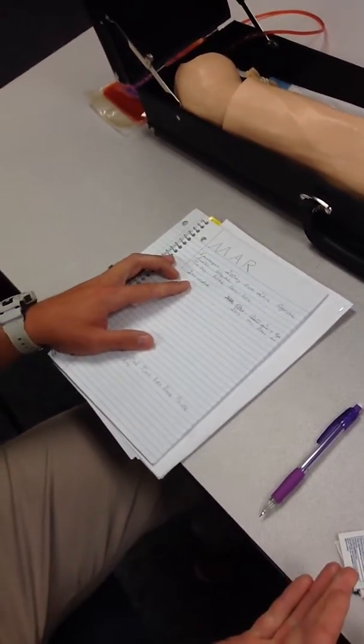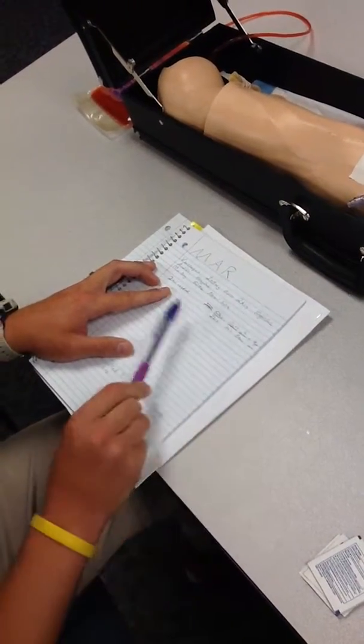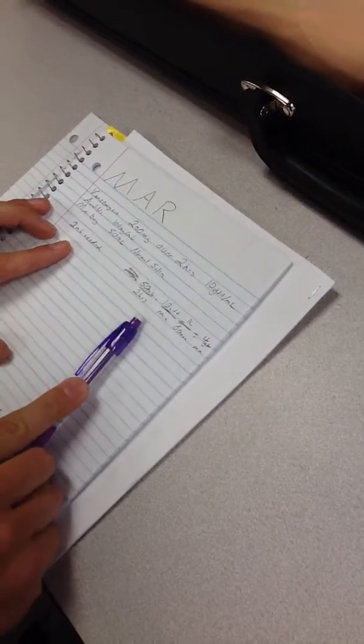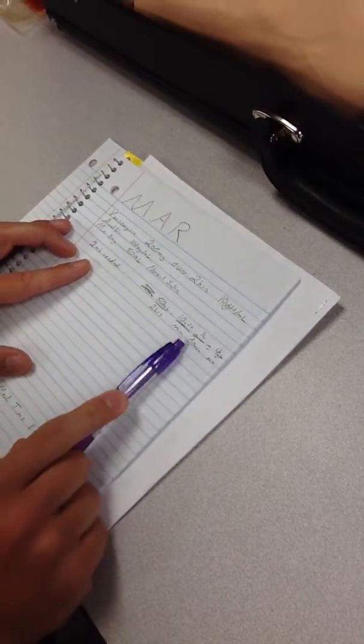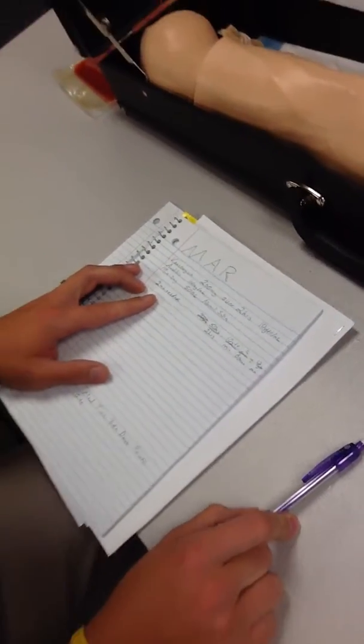Then we will instill it into the Minibag. It needs to go over 2 hours, so we will use dimensional analysis: 50 milliliters over 2 hours, at 10 drops per milliliter, times the rate of 1 hour over 60 minutes, will be approximately 4 drops per minute. So we will get started here.